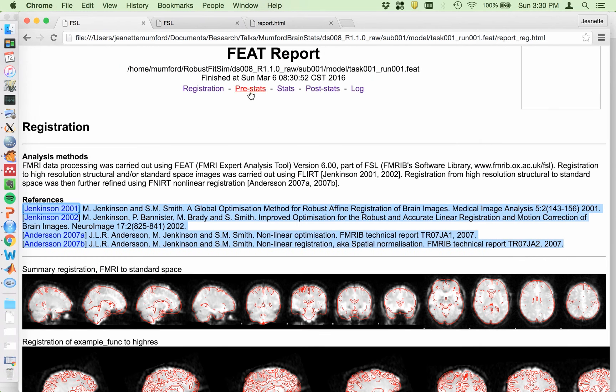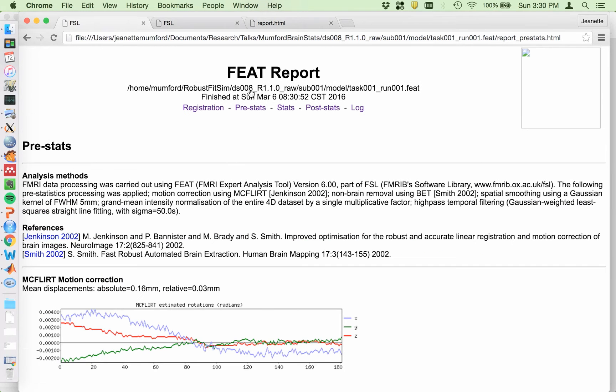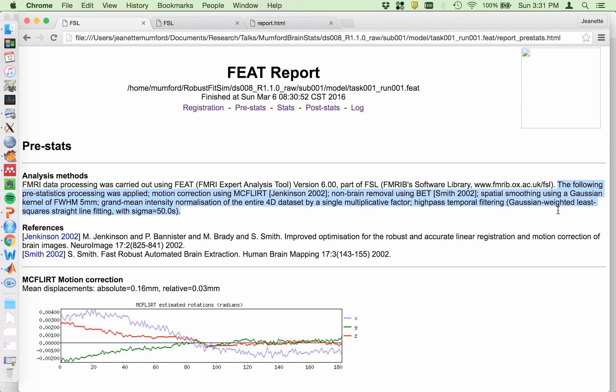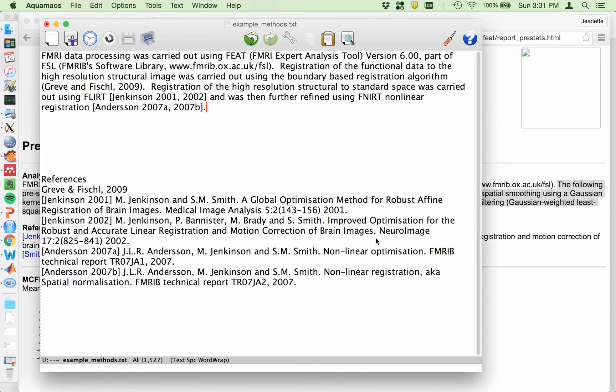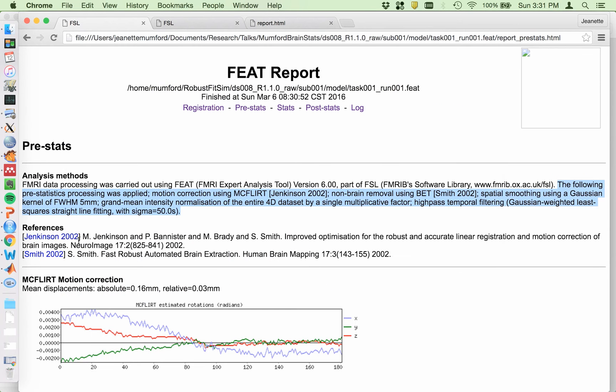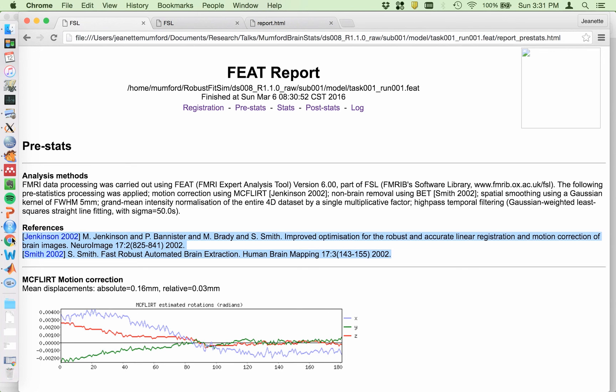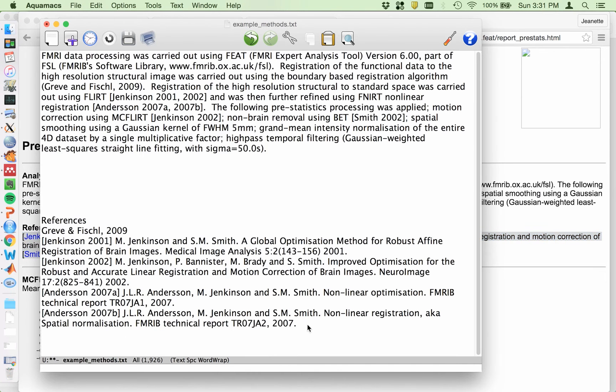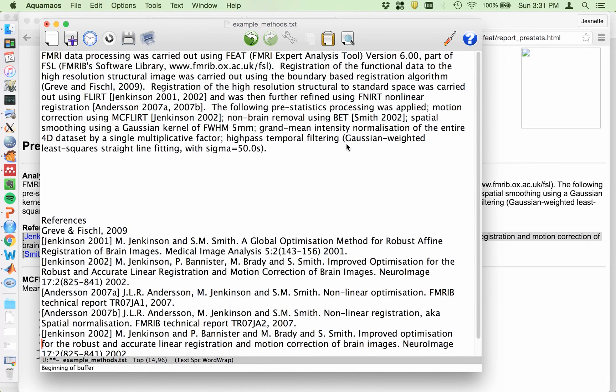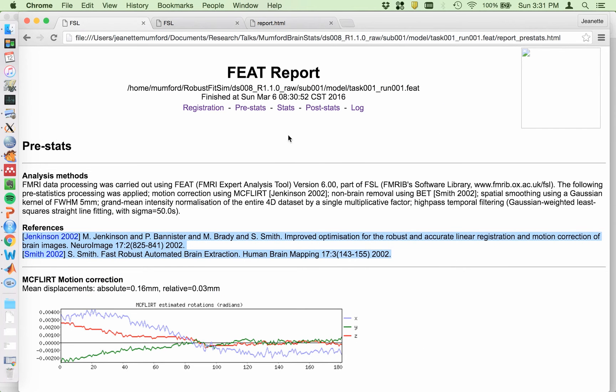Going back. So now I'm going to click on the PreStats tab. So again, this first sentence is going to be repeated each time. This is just saying you used FSL. So we're going to go to the second sentence and on. So this is just talking about motion correction using McFlirt. BET for the brain extraction. Spatial smoothing using full width half maximum of five millimeter. Grand mean intensity normalization. High pass temporal filtering, et cetera. So copy and paste that to here and get your references. Some of these references might be repeated, so you can check that later. Usually your bibliography tool will do that for you. Done.